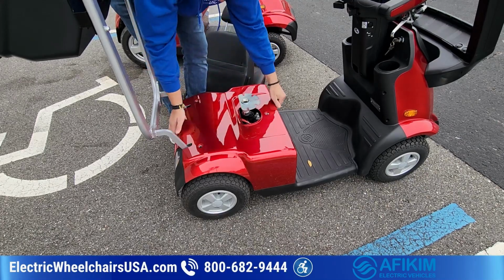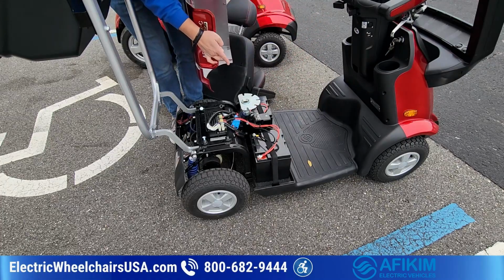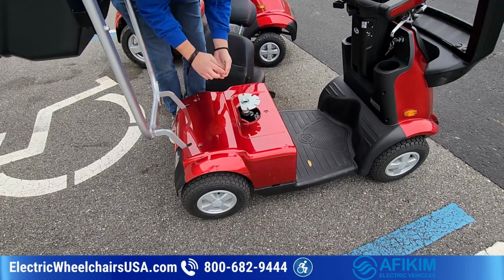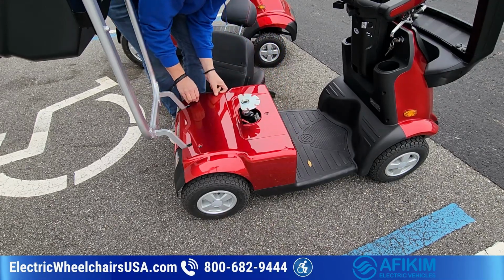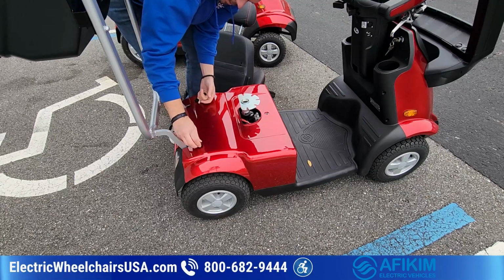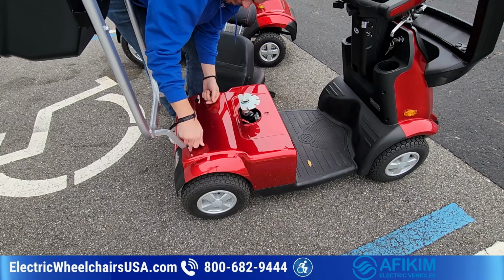So when I remove these, this panel comes off, and that's where you access your batteries. So you have to disconnect these and take them inside if you live in a cold environment. Now, if you live somewhere warm, you're not going to have to worry about that. And you access the batteries the same way on any of the C models and S models, just like this. You got to remove the seat and these screws.